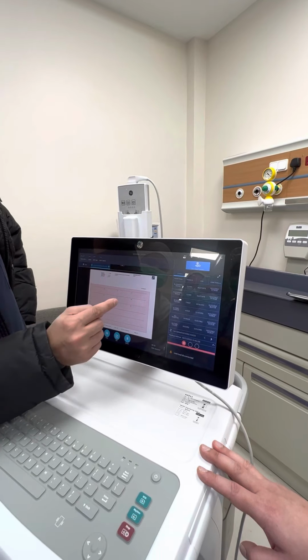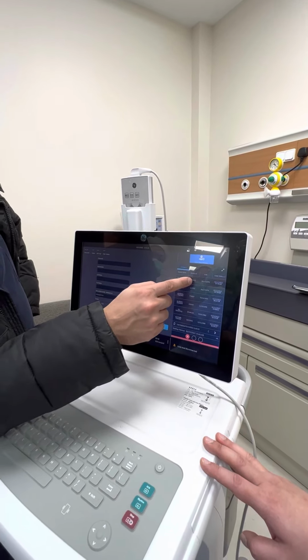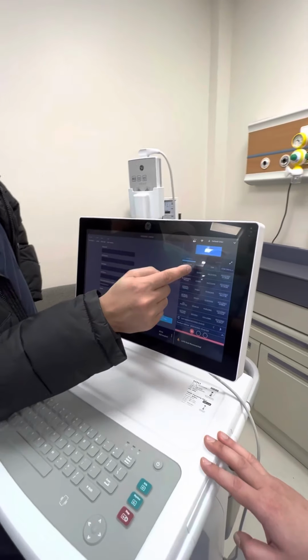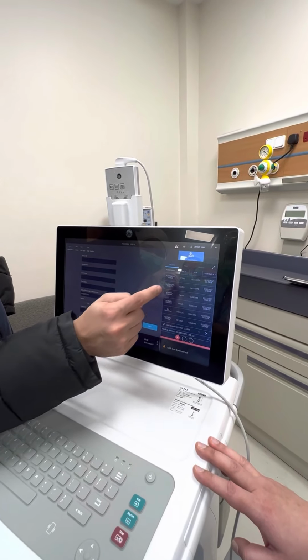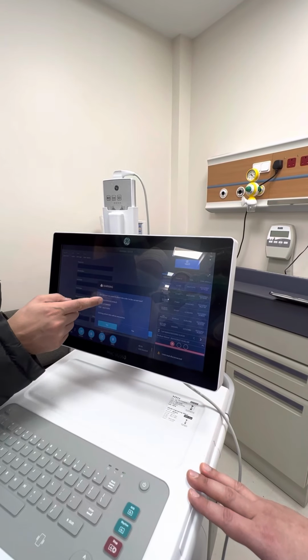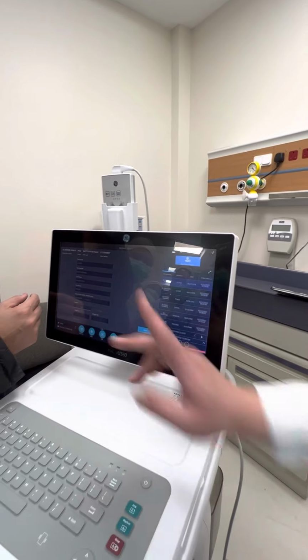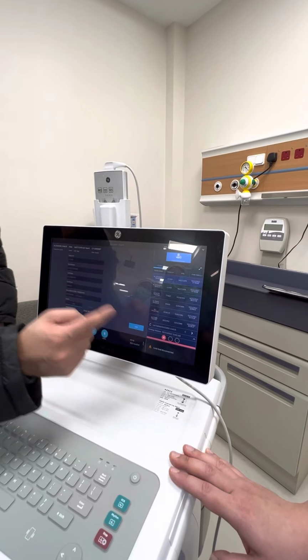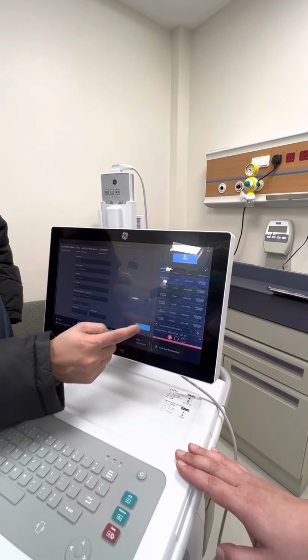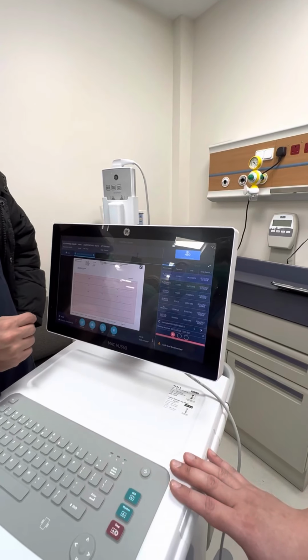Why no response? What's the message now? Otherwise you have to repeat. Warning: are you sure you want to attach this file to the current test? Yes. Now it auto-populated. Then you will do save, then you will do the transmit. Okay, save and transmit. Don't just transmit.